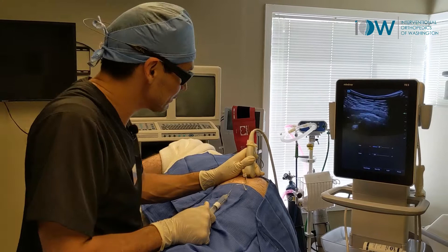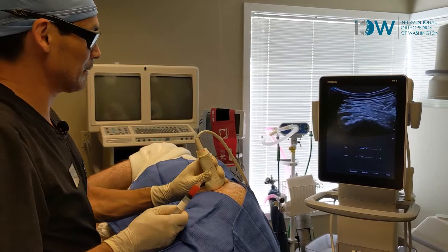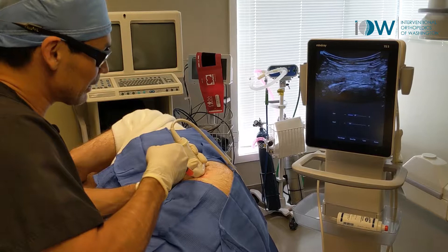We're going to finish up with some PRP. There's the rooftop of that greater trochanter. Anteriorly, we swing into that glute minimus attachment. You can see it right there, that lower attachment right there. Let's go ahead and take a little bit of PRP and put it in that guy.